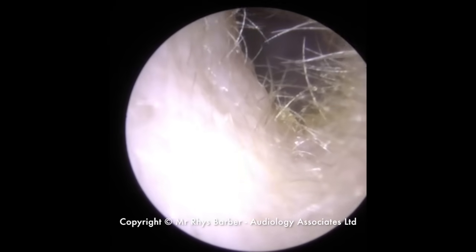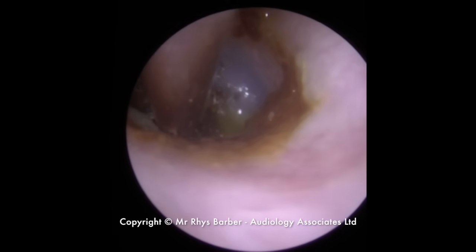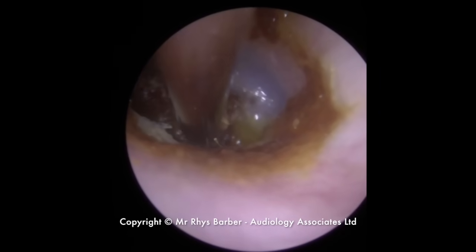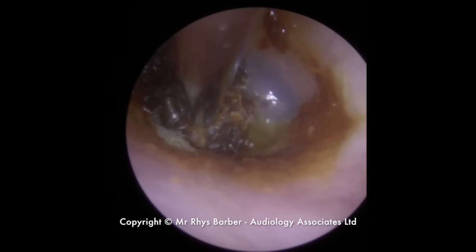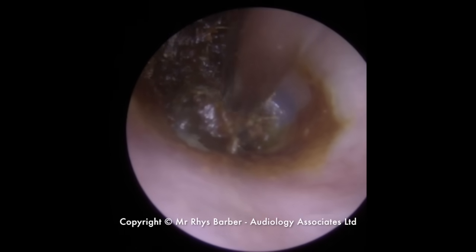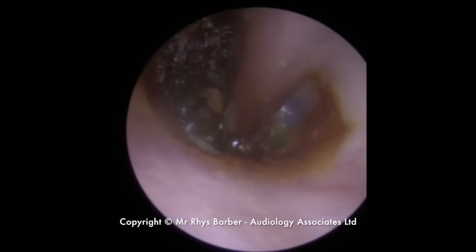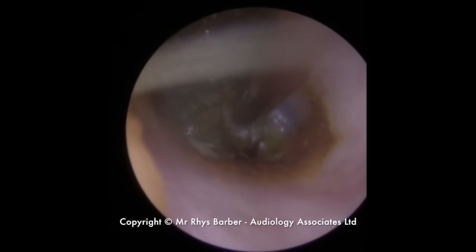I think it's actually sitting on a piece of dead skin, which is sitting just in front of the eardrum itself. Just trying to find any kind of movement or any loose section of wax there to work on. You can see it's starting to move. I'm taking the top section away there a little bit, still trying to be very gentle with this, trying to tease this away as best we can.